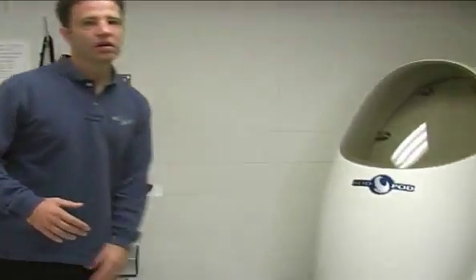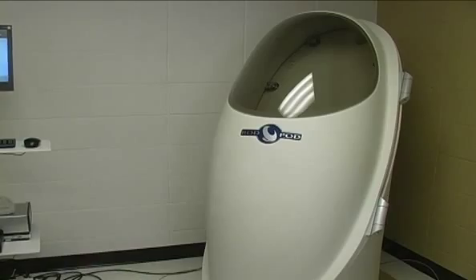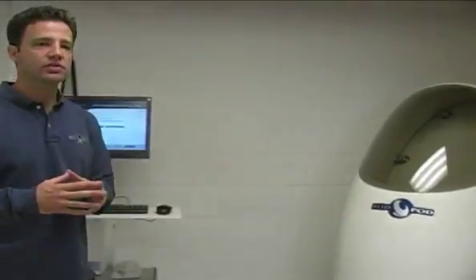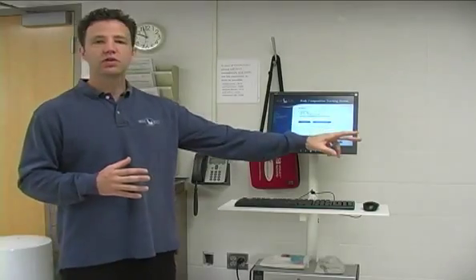The metabolic portion of the BOD pod is not indirect calorimetry. What it's based on is a formula. The BOD pod is considered the most accurate device in the field for research for body composition. So if you have an accurate device to assess fat mass and fat-free mass, then you will get an accurate value for this metabolic measurement. And what it's based on is those two components. It's based on the Nelson formula, which was published in the American Journal of Clinical Nutrition.